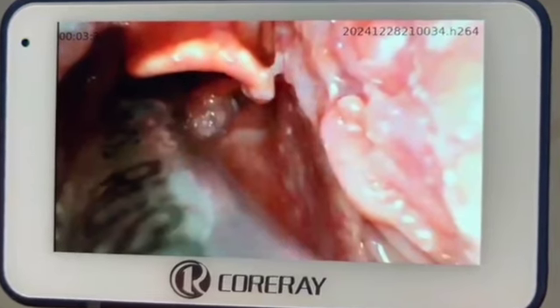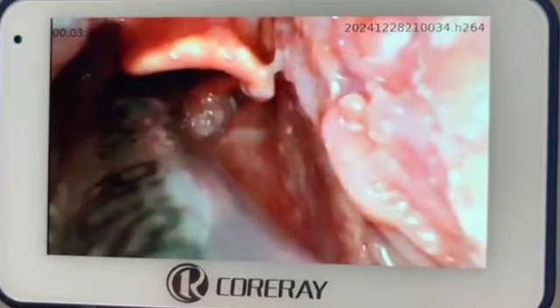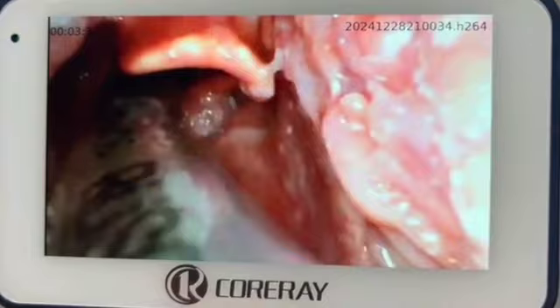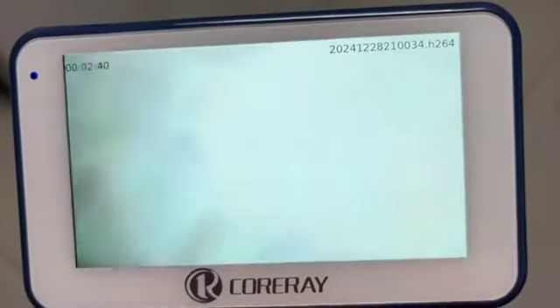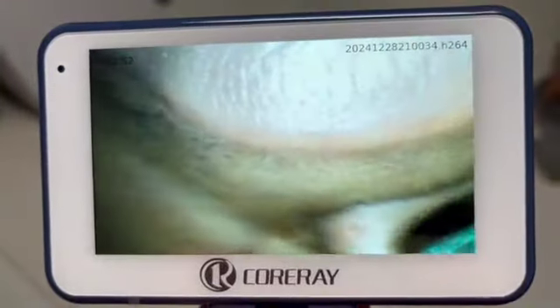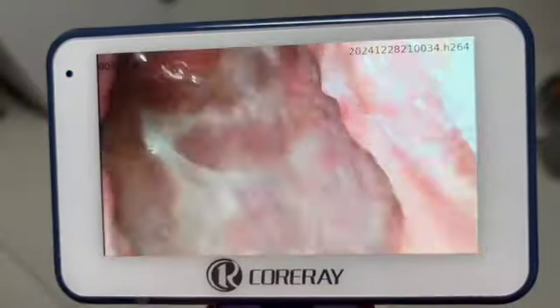So in the space of a very short sort of airway approach, I think we're looking at 40 odd seconds. In 40 seconds, there are 4 errors that were made, and it's not the first time that I'm using the video-laryngoscope, teaching with it so often. So the first error was placing it not under visualization because of the angle standing behind the patient and not seeing it move into the frenulum space of the tongue.